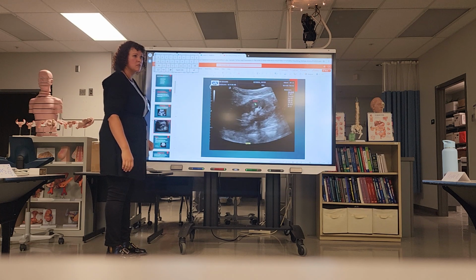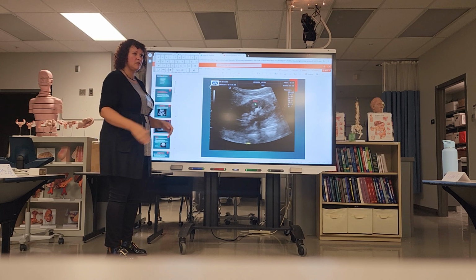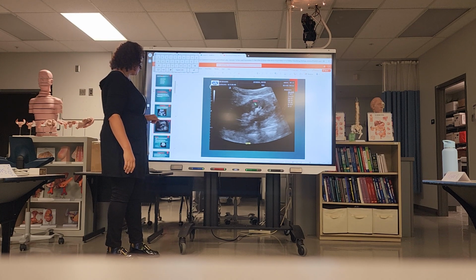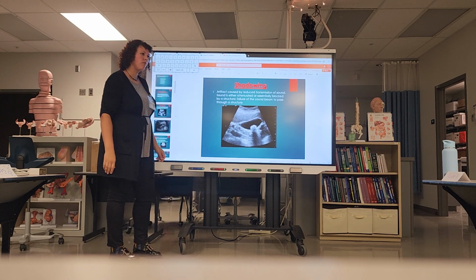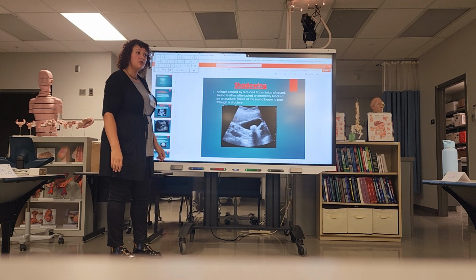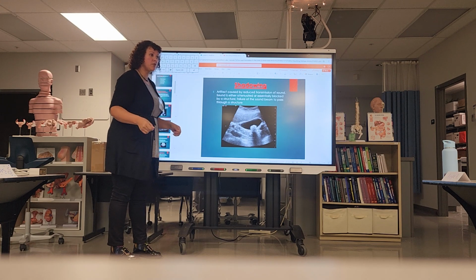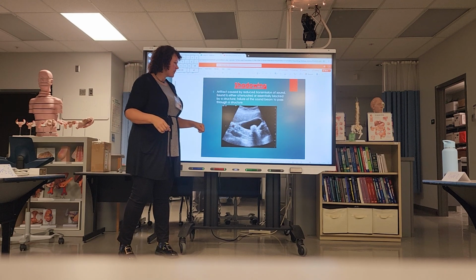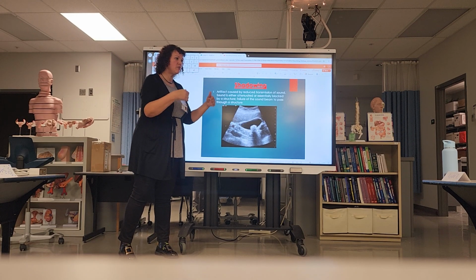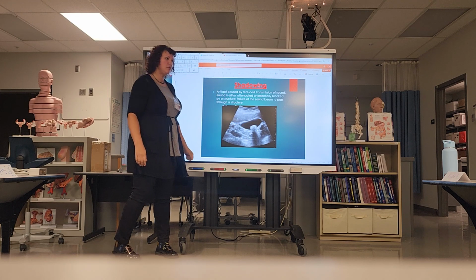Do those move as the patient moves? So like if you rolled her over, you're gonna see it move? Yeah, roll them LLD. That is so cool. Yeah, and then it'll roll right into the fundus. Would you have to get like a video clip to verify it's mobile? You can if you just want to give the radiologist a thrill. But you would just take an image like this, and then an image with the patient rolled over, showing that it moved. Yeah.